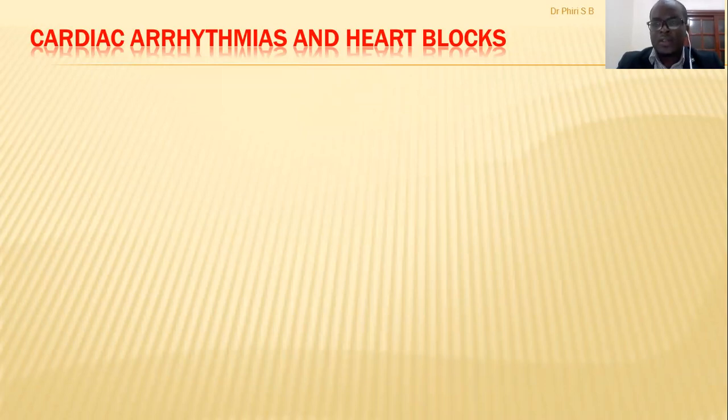So in Circulatory System Lecture 3, Part A, last time we were discussing the EKG recording, or the ECG recording. We were looking at the 12-lead ECG machine. We use the 12-lead ECG machine to look at the heart. You have 12 leads, so there are 12 angles from which we look at the heart. Of those 12 leads, we had 6 limb leads and 6 chest leads.